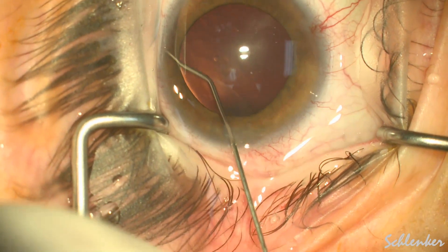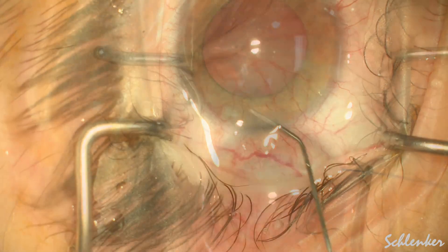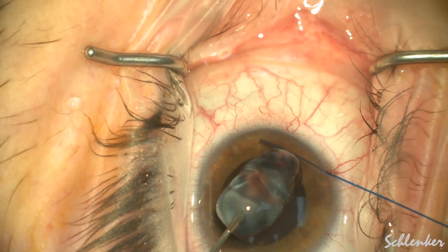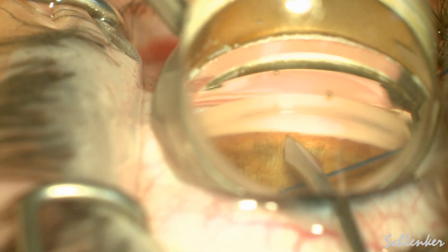Generally I do not use miochol, but did in this situation just because she has a clear crystalline lens, and I knew I was going to be doing some goniosynechiolysis as well.